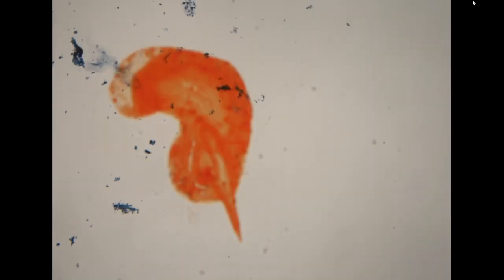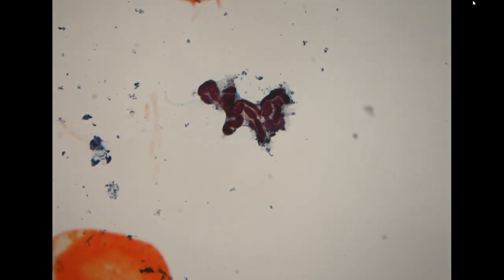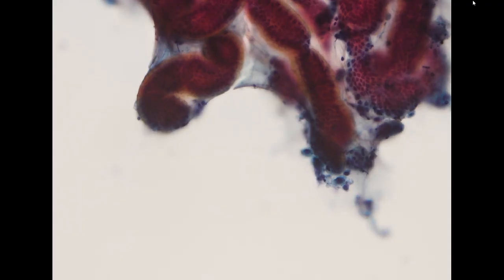The next specimen is a fine needle aspiration. This is from the pancreas. This is an ultrasound-guided aspiration. This specimen is a little bit difficult, but we do see some very high-grade cells. Okay, so the difficult part is over here.